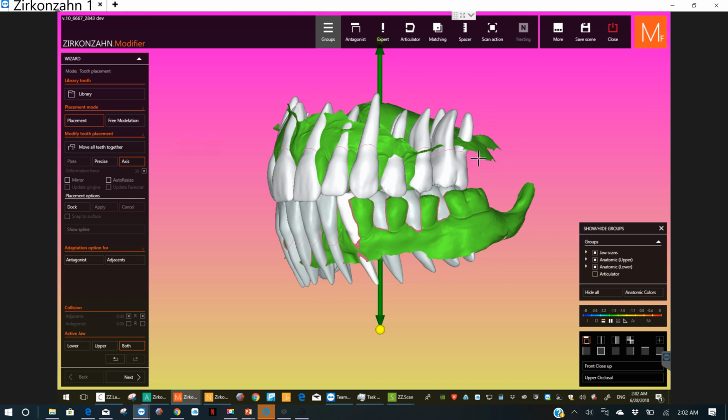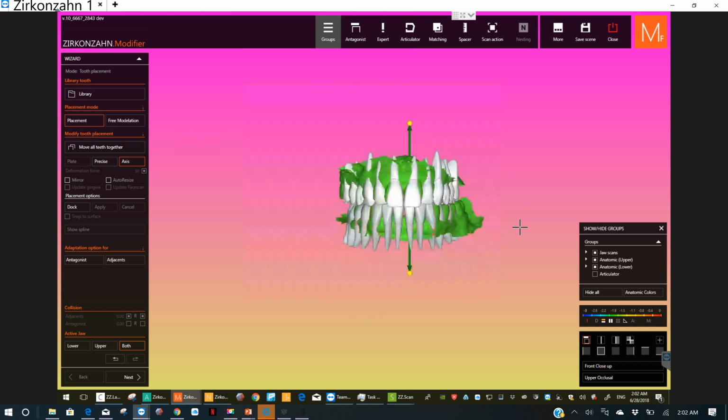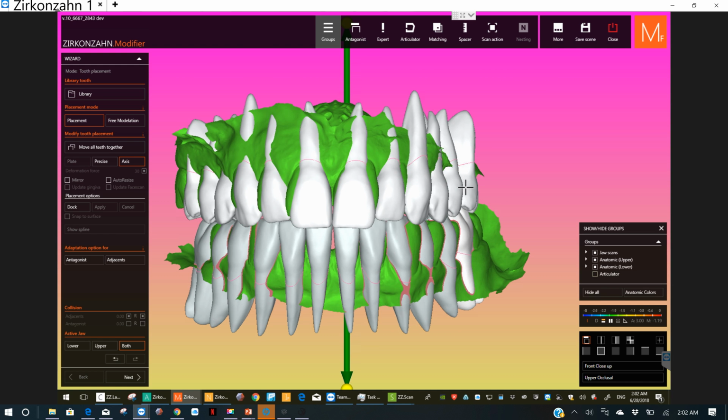Wish we had a little bit better scan right there. Tough spot. I think I just made the smile too narrow. I don't want to compromise her smile over that. The more times you do this, the more you'll start taking better scans when you see it. Okay, and then you can go around and fiddle forever.